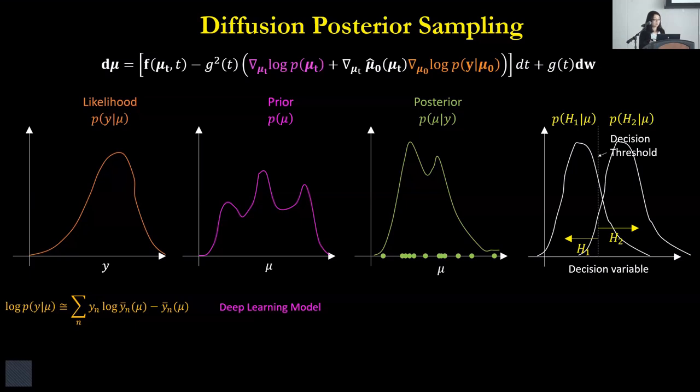However, a lot of the clinical decision-making process still relies on human observers, and human observers are not ideal. In fact, we're very suboptimal observers. Radiologists are also traditionally trained to just read one image sample, especially in CT. So if we run DPS once and present a random sample to the radiologist, we can get very unlucky and lead to a wrong decision.